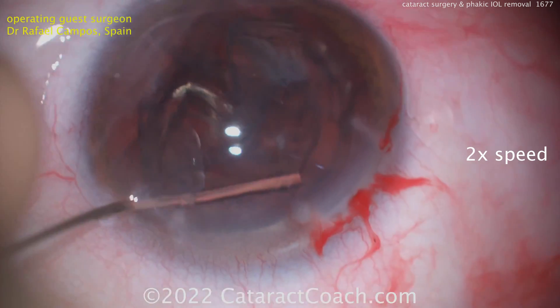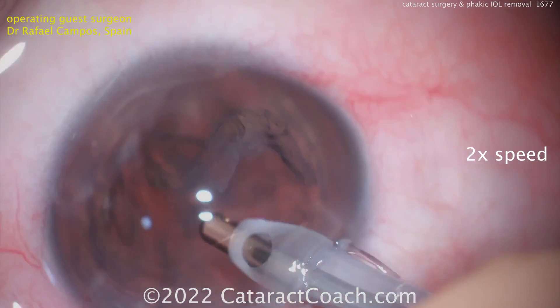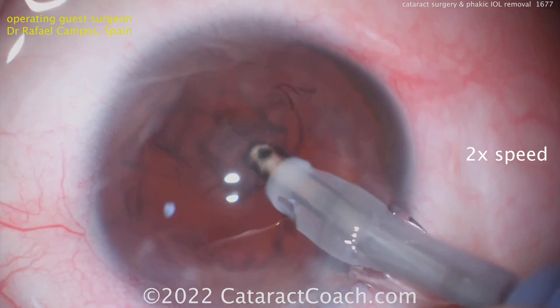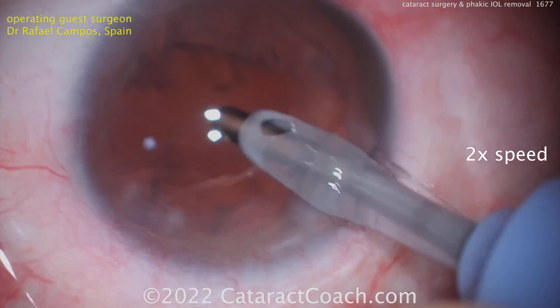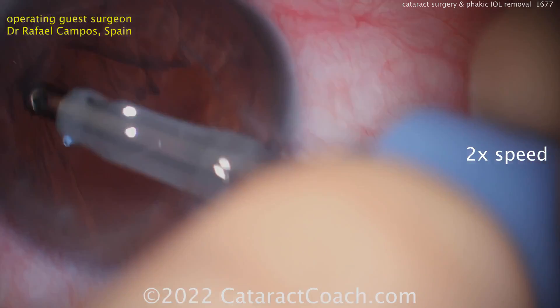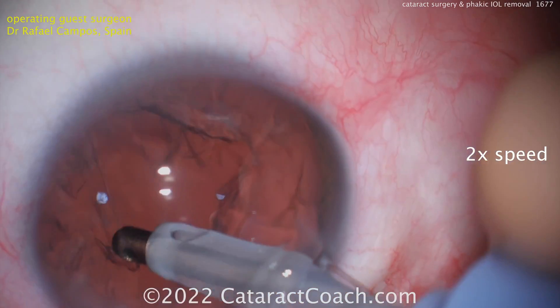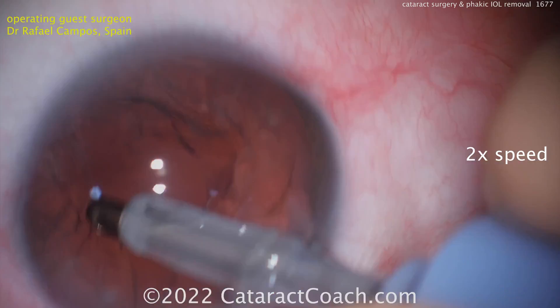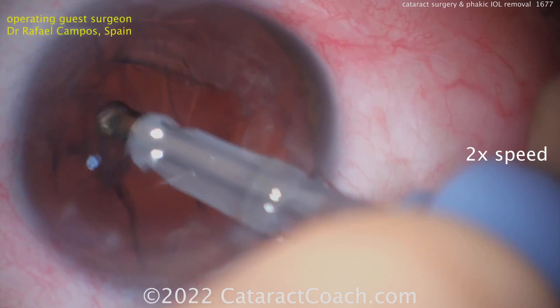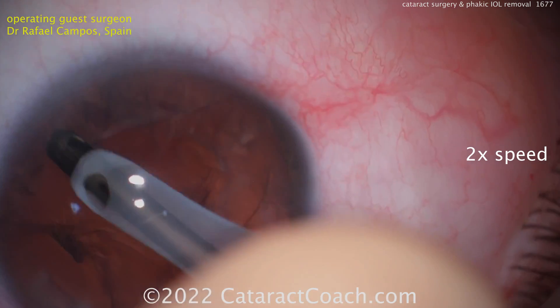More dissection there — that looks great. I like how the limbal vessels were nicked; that's going to allow it to really seal up beautifully. Now removing that cortex — very nice. Getting that out 360 degrees. Let's see what the lens choice is. I'm watching the video for the first time with you. I did speed the video up to two times normal speed, because ophthalmologists like things quick.